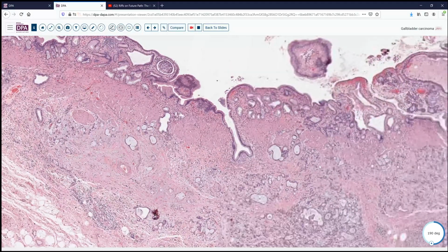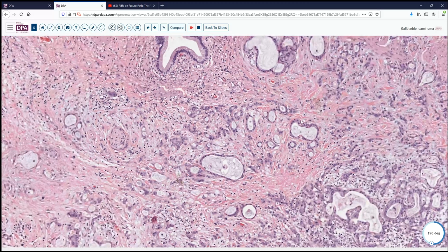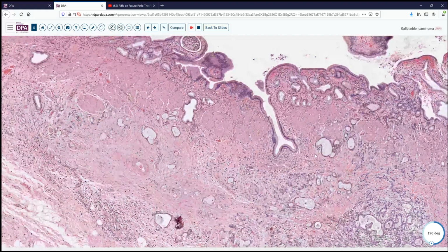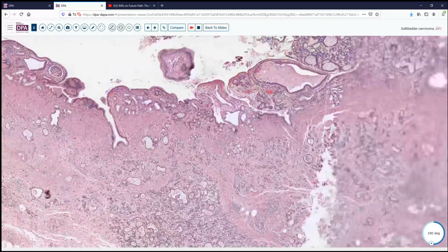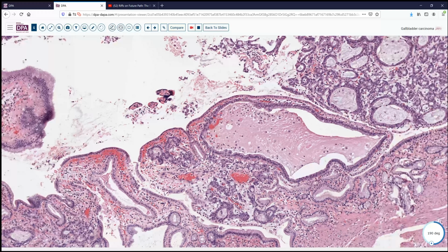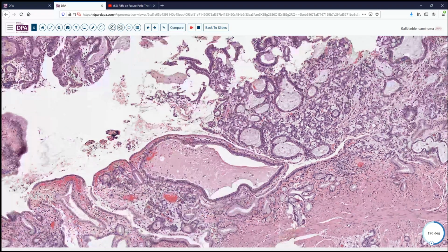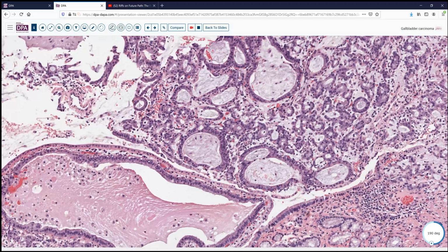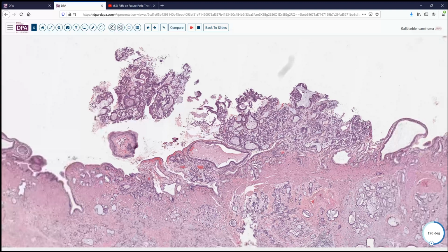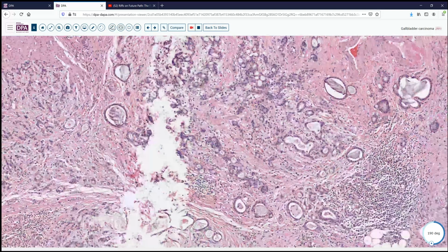So moving further along here into the lesion, we note that there are areas where we have some larger spaces, some of which have mucinous content associated with some of these infiltrative type processes, and other glands like this which still appear fairly normal. Even here, very close to the surface and center of the tumor, we can see some areas where the glandular epithelium looks fairly benign and typical. But then adjacent, we have this complex pattern of large and small glands with a desmoplastic type stroma or a mucinous type stroma around it, an inflammatory reaction going along with it, almost as though there's been a polyp here, and then deep to this polyp is this invasive neoplasm that has glandular configuration that is fairly small.